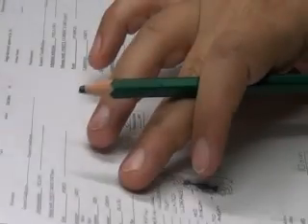Why do I need the addition now here? For cross arch stabilization. Okay? I need retention from the other side. This will be direct retention, so I'm going to place a double Aker somewhere here. So these are new reasons to change if our laterals are the abutment here. So we are only left with the lateral with a guide plate. Now look at the other side. What do we have at the other side?